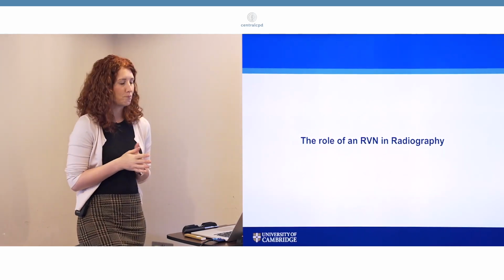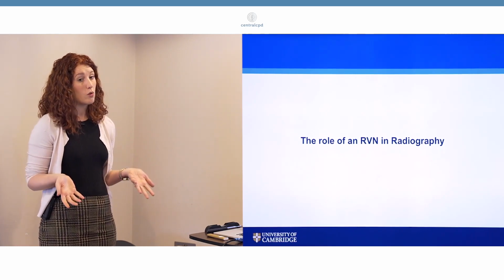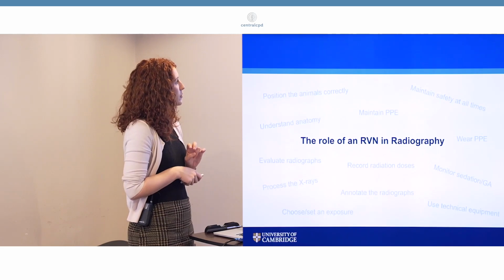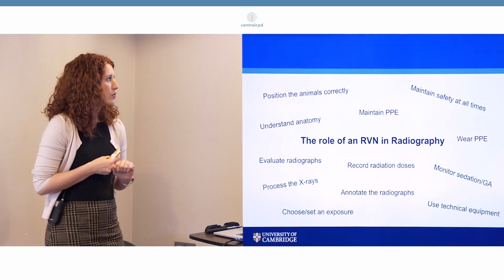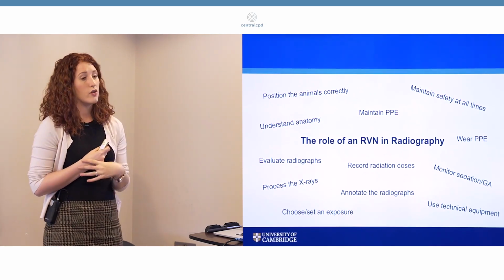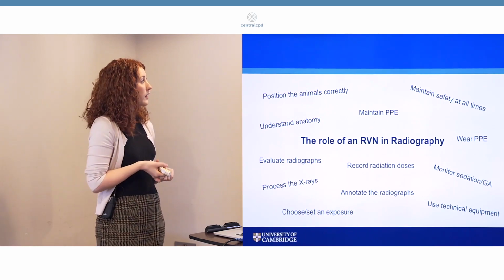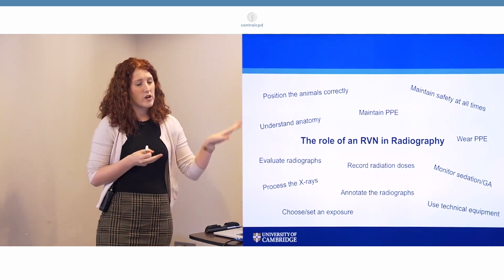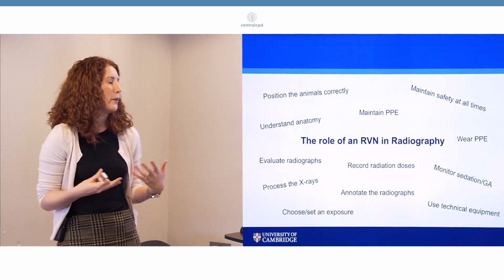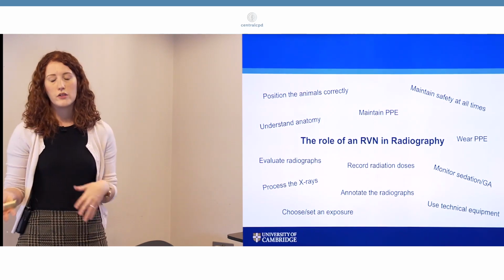Yeah, so I guess what I'm trying to highlight is you have quite a big role in radiography, and it's quite a lot of things to remember. So I've put some things around here. We haven't mentioned all of them, but some of them we have. So obviously you're going to be positioning your animals correctly. You've got to have a good understanding of anatomy. I've put evaluate radiographs, but obviously I know the vets come in and have a look at them, but it's good for you to look at them and think, okay, yeah, that's diagnostic or not, and do I need to repeat it?